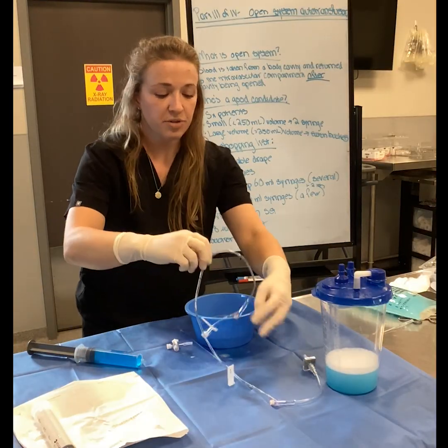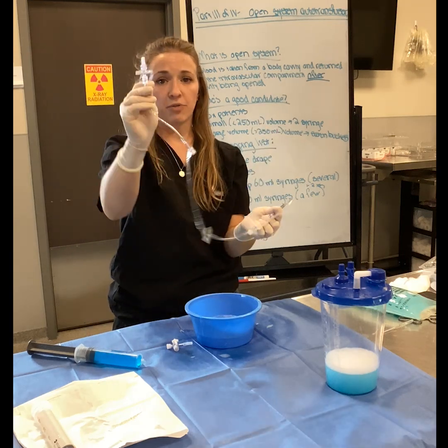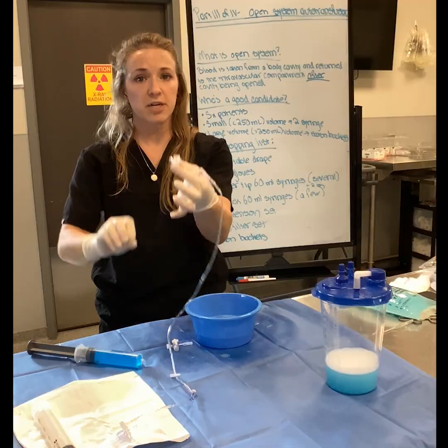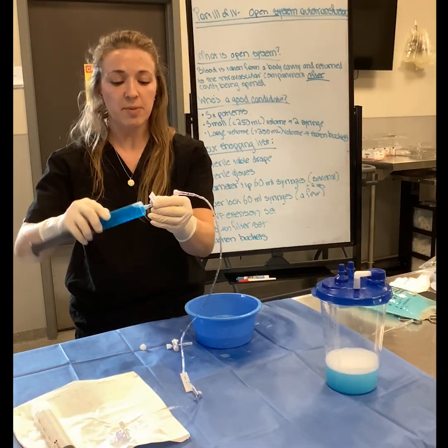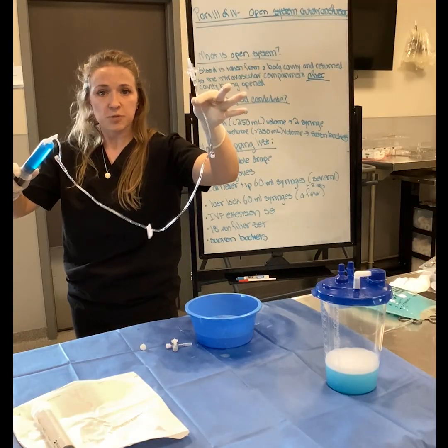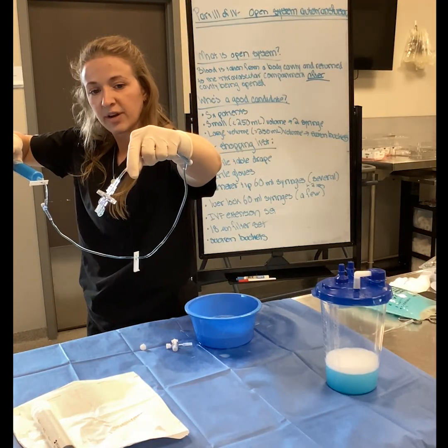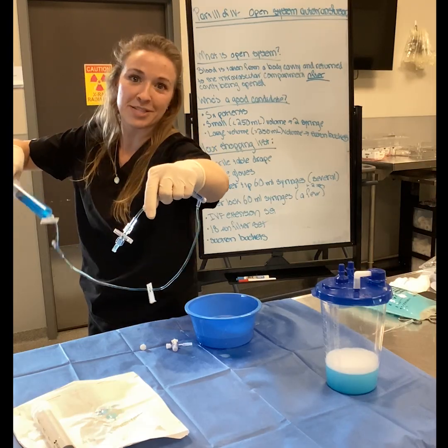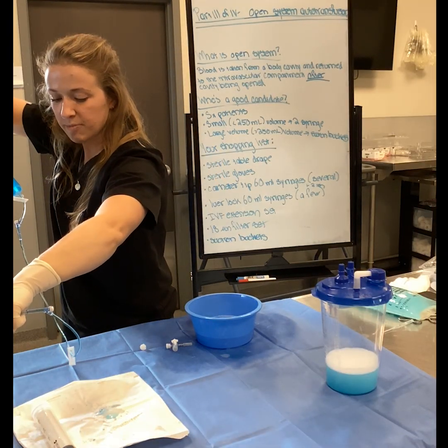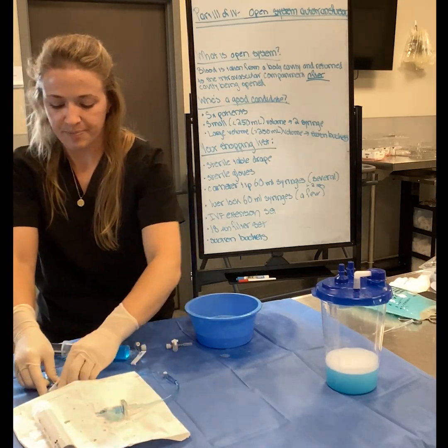The next thing that I do is that I have my extension set with my little filter on the end. This is going to go to the patient's IV catheter, and this end is going to be what I'm working with. Again, try to keep it on your sterile drape the best you possibly can. And now at this point, I'm able, and you can see that fluid kind of traveling through there, yeah? There we go. We'll pretend that's blood. And now you can take blood that was aspirated from the abdomen and give that back to the patient.